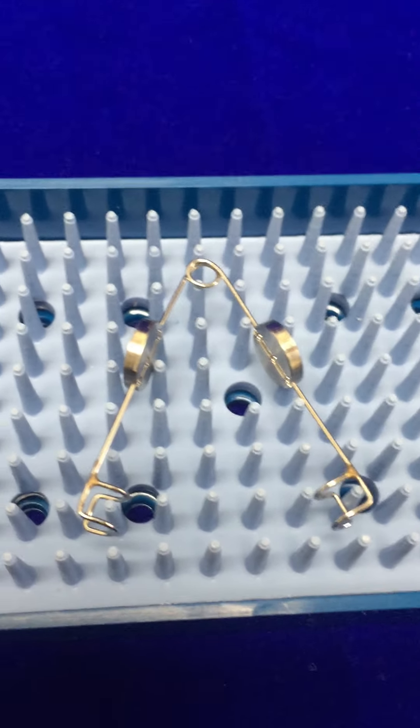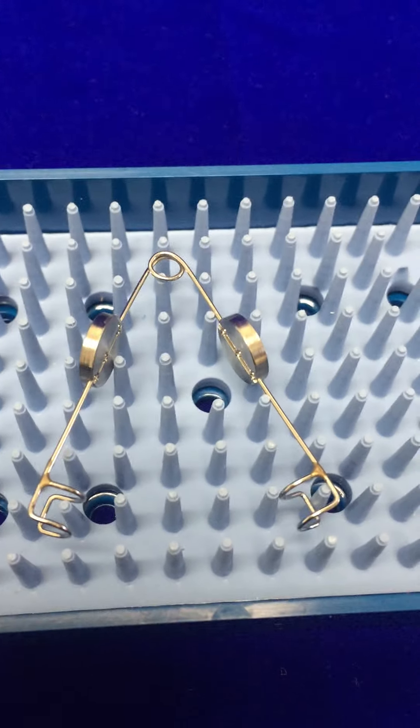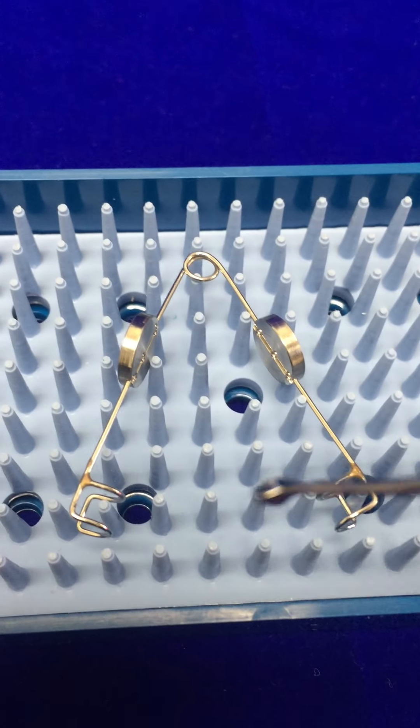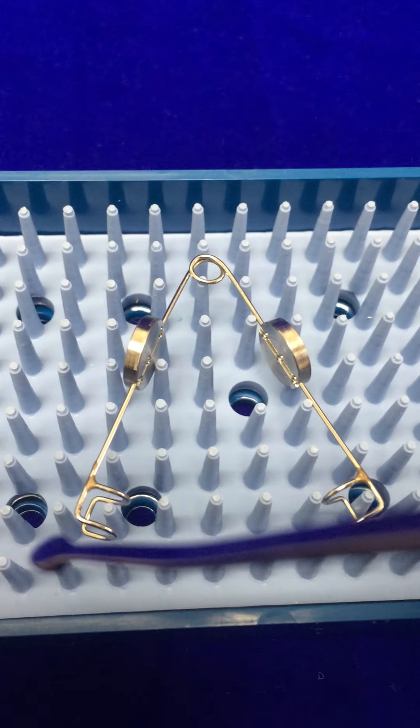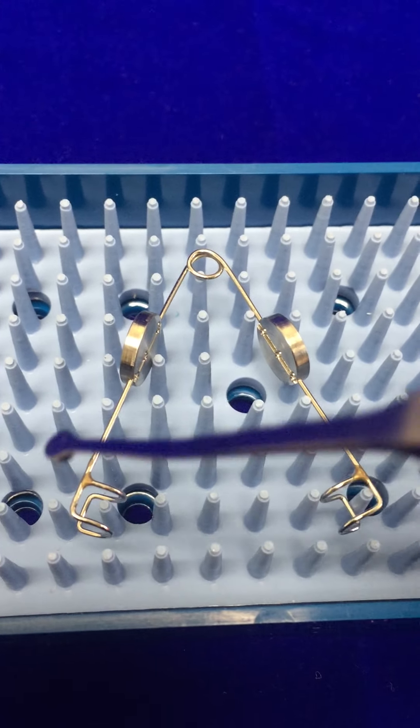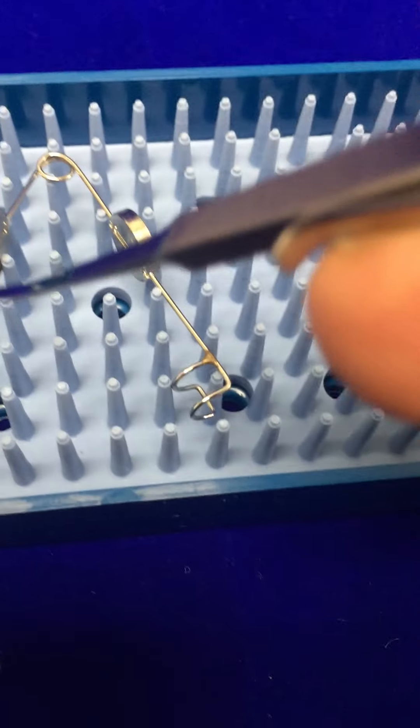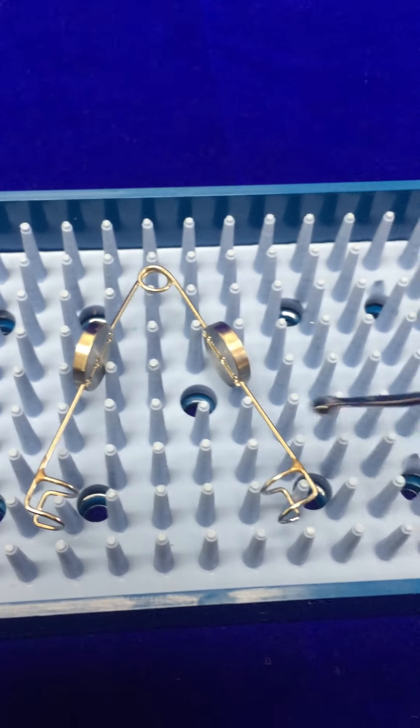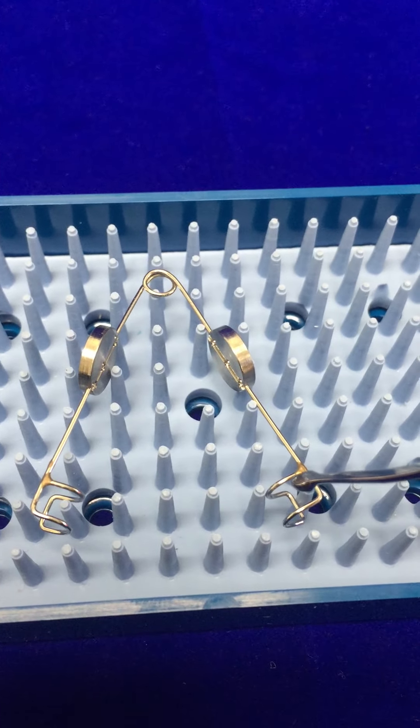There are two solderings here to connect the lid to the speculum. One is here and another one is here.